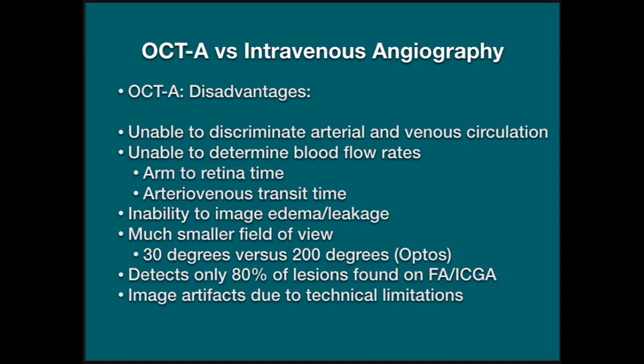Angiography via OCT looks for movement of blood in vessels. If blood has already left the vessels and has pooled somewhere, or it's within an aneurysm and has pooled somewhere, OCT angiography may not be able to detect it.